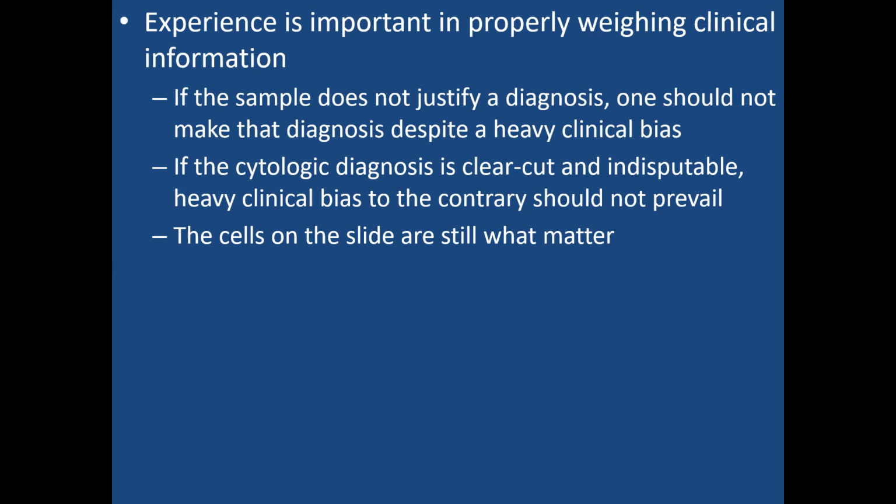But you go there and you don't find anything, and you look around, trying so hard to make a diagnosis which goes with what the clinician has made. Now, if the sample does not justify that, you shouldn't do that. You shouldn't try and make a diagnosis of a positive case because of the heavy clinical bias, because the information provided to you is pointing so much to that.